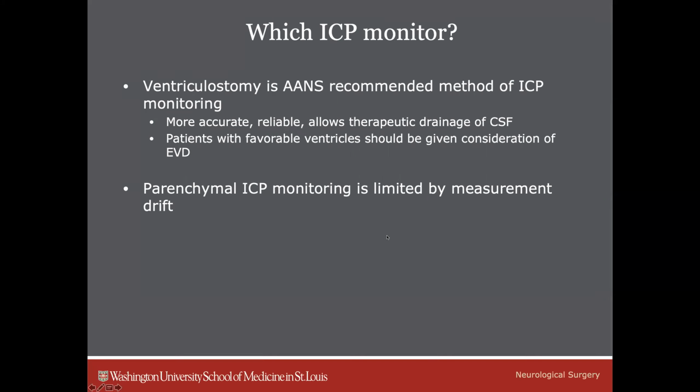Again, the bolts that we use, one of the biggest limitations that we see is that there is drift in the actual value over time. And then sometimes, patients who've had an ICP monitor for a week or so, we have to replace the monitor because of the measurement drift.